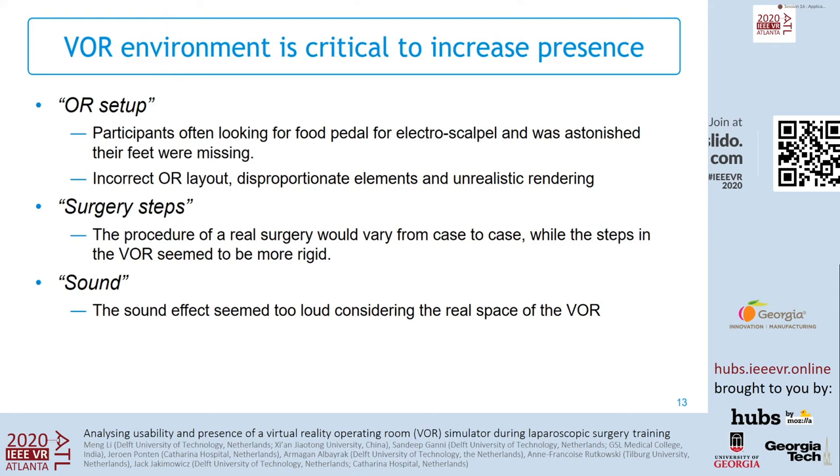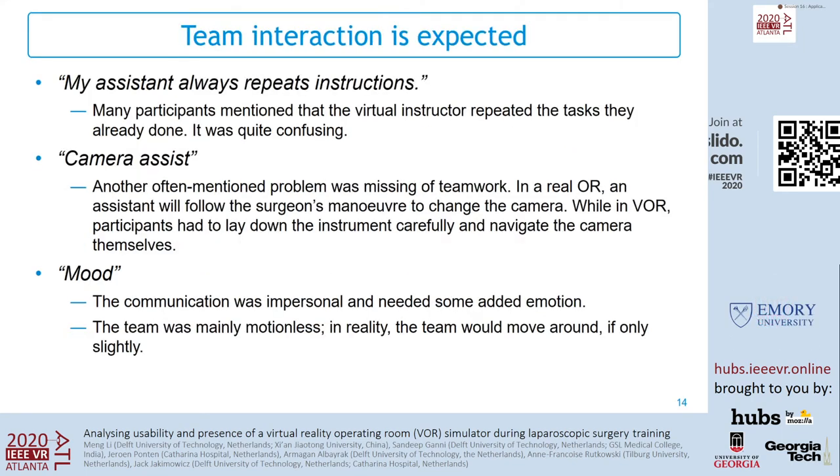The environment is critical to increasing presence. For the VR setup, most participants noticed that their body parts, for example their feet, were missing within the VOR. The incorrect OR layout, disproportionate elements, and unrealistic rendering also caused an unrealistic experience. For the surgery steps, there are slight differences in a real OR, but the steps in the VOR seem to be more rigid.